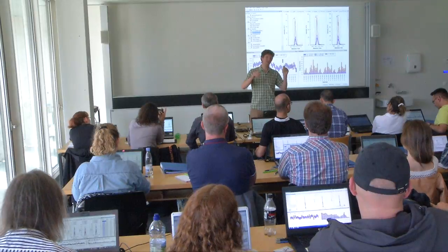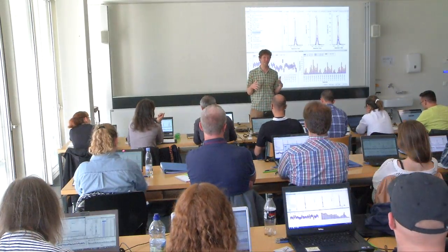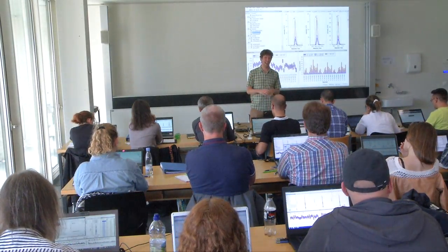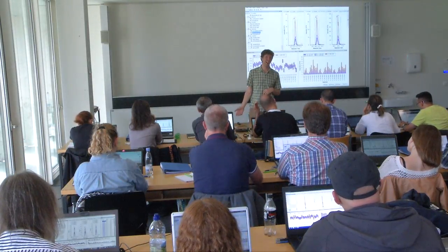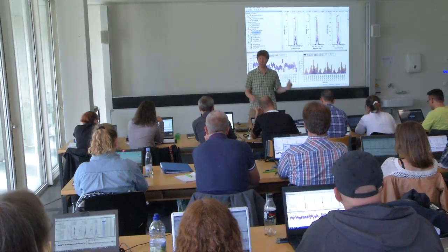and to actually see how you can go through these processes of processing things, but Skyline also allows you to just launch into directions of inquiry that are driven completely by you, and get to information very, very quickly. I liken it a little bit to this: I was at a conference, and somebody had done a presentation where they said, oh, there's all this imaging data, and we're going to make this amazing platform that does all this amazing stuff. That'll be a black box, and that will just give everybody a report.